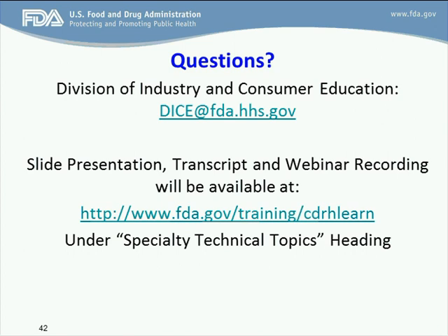An additional comment with regard to the ethylene oxide residuals. The guidance document does refer to AAMI ST41 and, as you mentioned, ISO 10993-7. The most helpful information you'll find will probably be in AAMI ST41 for designing an aeration procedure. Okay, thank you.